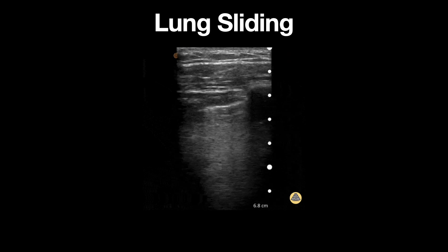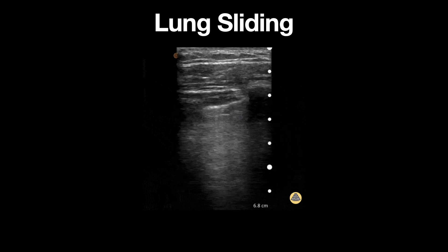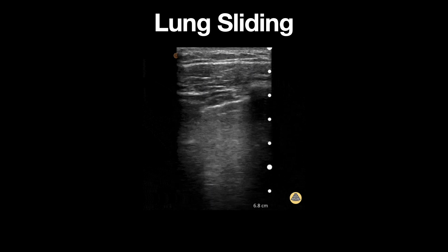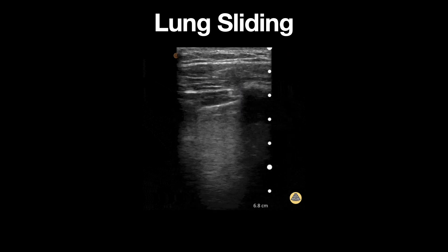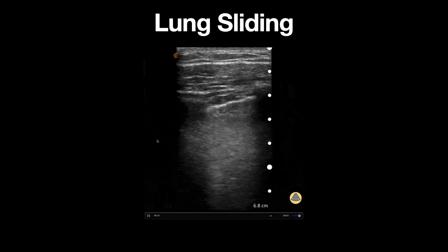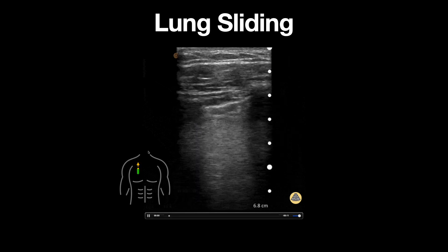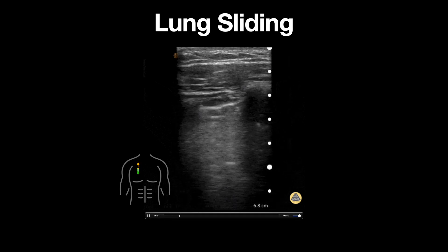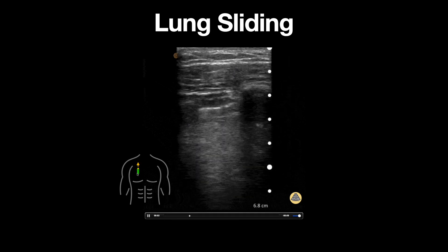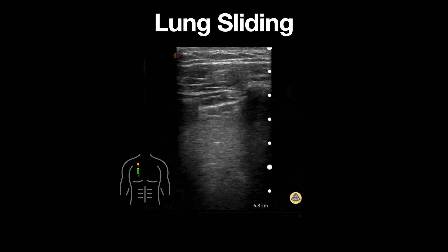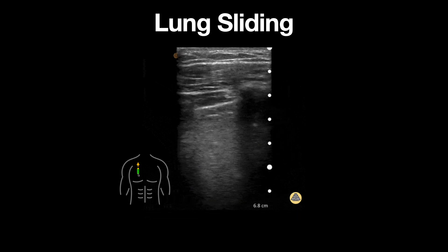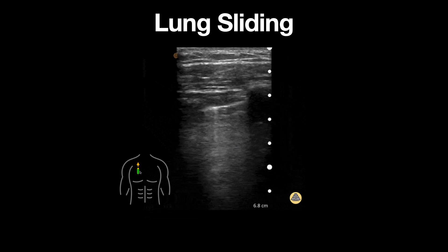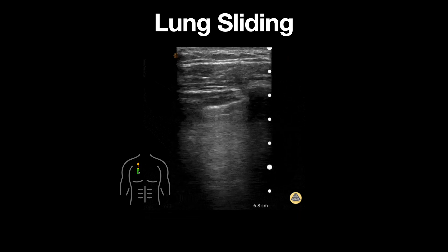This is an ultrasound clip demonstrating normal lung sliding, which rules out a pneumothorax at this lung space. A linear probe is used and placed in a parasagittal orientation along the chest wall, spanning a single intercostal space.